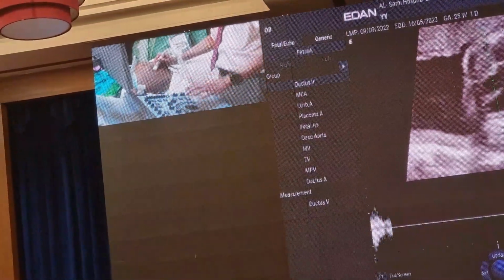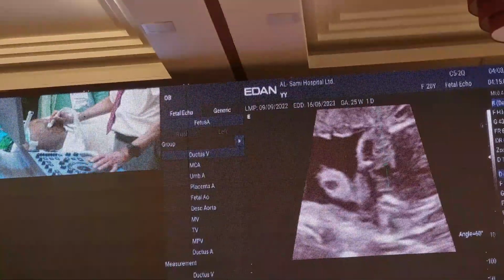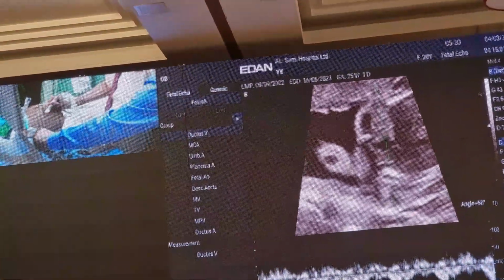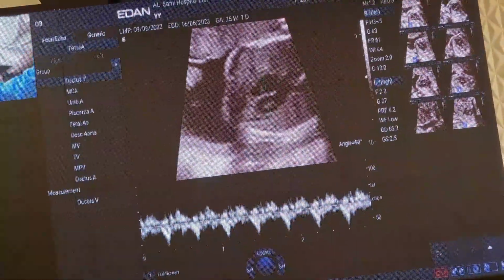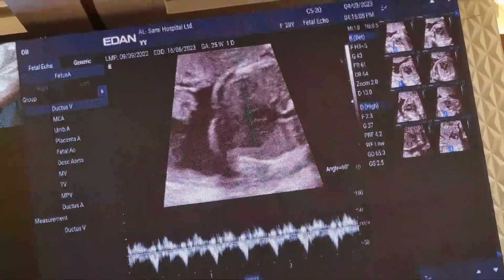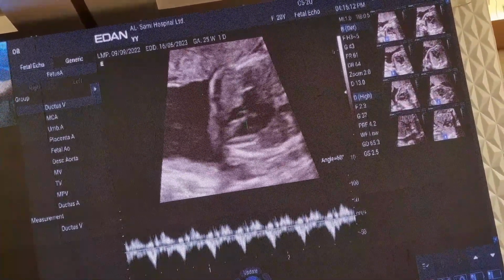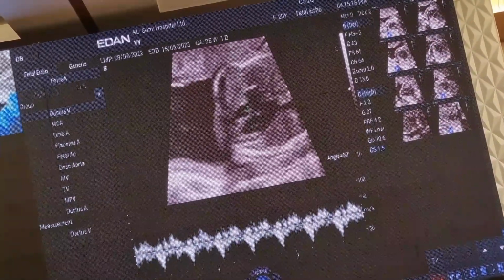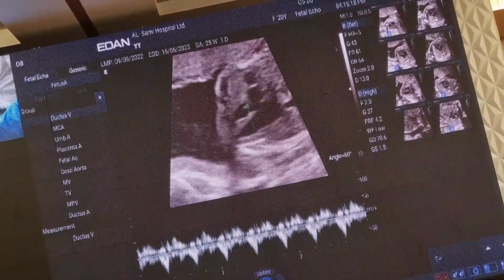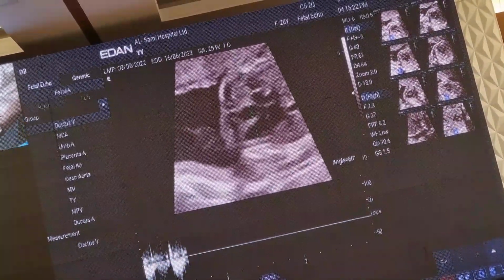Now go to real time again. Update. Okay, maybe you can decrease your width, the volume. Yeah, small. Now do sample. Yeah, now you'll get a crisper waveform. Update. Trace. Update. Yeah. Oh, it will move.